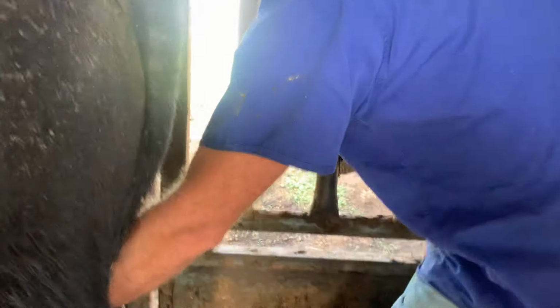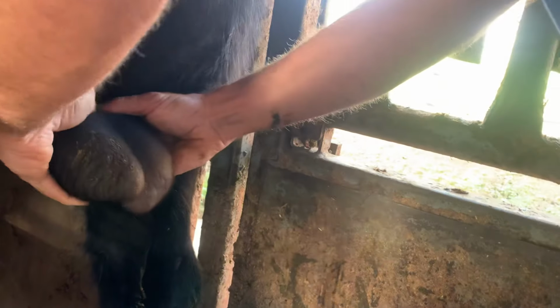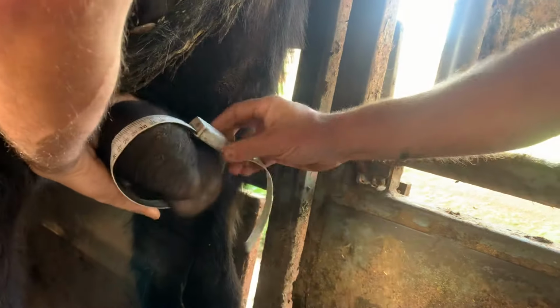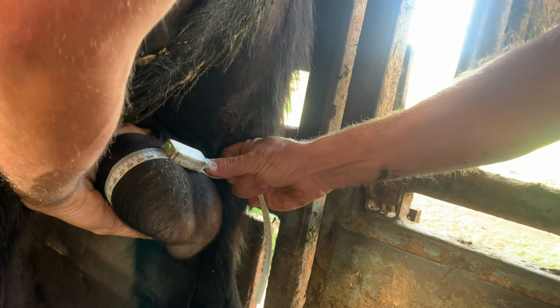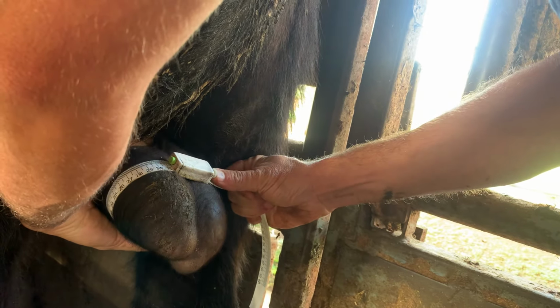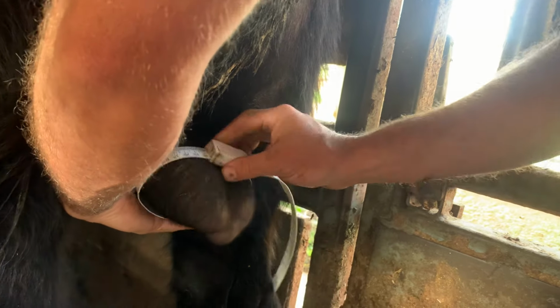So you grab his scrotum and put it behind you. Feeling the epididymis in that, and then come across with this called a Barth's and measure it and see where that transition is. As we're going, you can see it transition, showing that I've pulled it far enough. I'd read him at a 32. So 32 centimeters and a 4 for tone. That's good. Looking at his hocks, looks good. Good young bulls. These are yearlings.